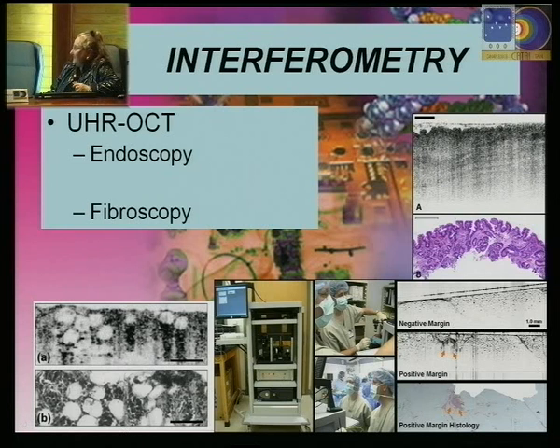What is nice is that you can obtain information without needing to have real physical biopsies.